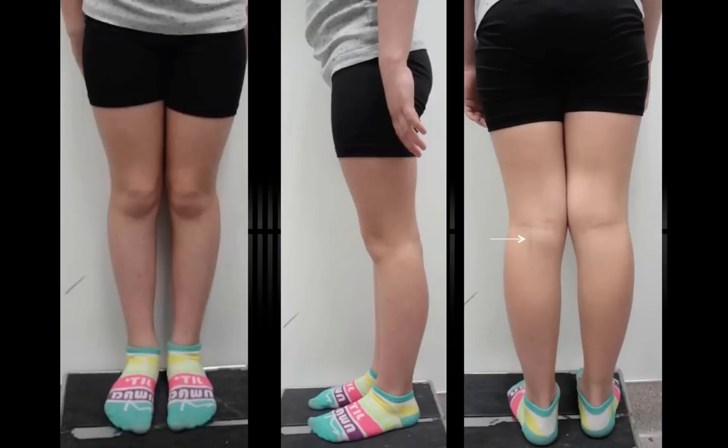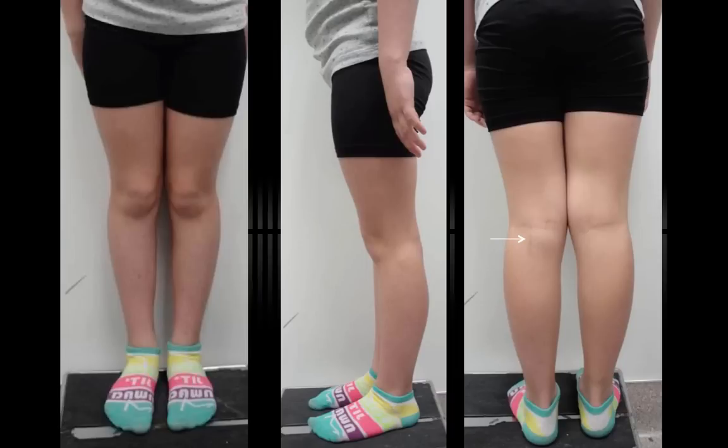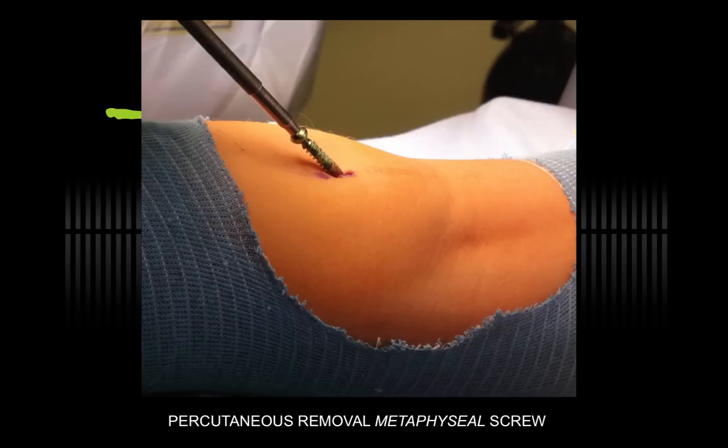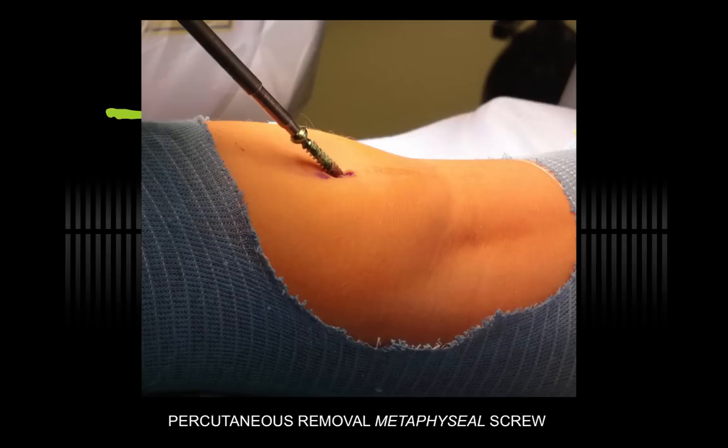You can see the midline scar posteriorly. She is a gymnast and has returned to all activities following this minor outpatient procedure. Shortly after that other film, the metaphyseal screw was removed percutaneously under fluoroscopic guidance, knowing that she has several more years to grow. With the remote chance that she has recurrent recurvatum, the screw could be reinserted percutaneously.